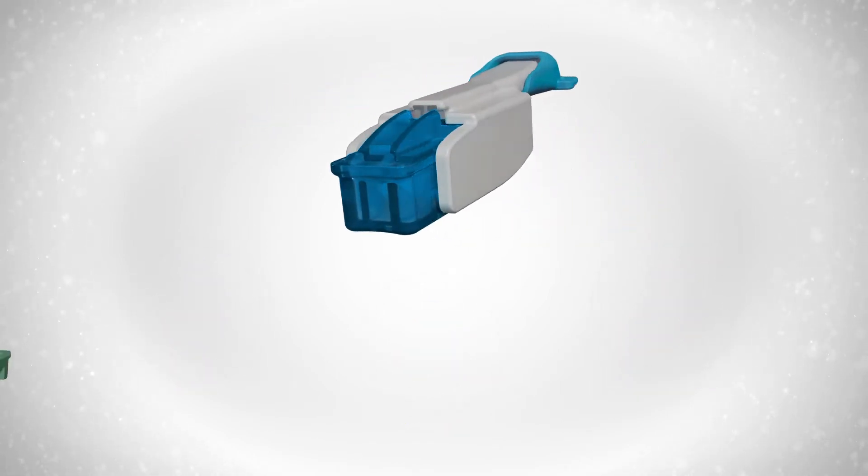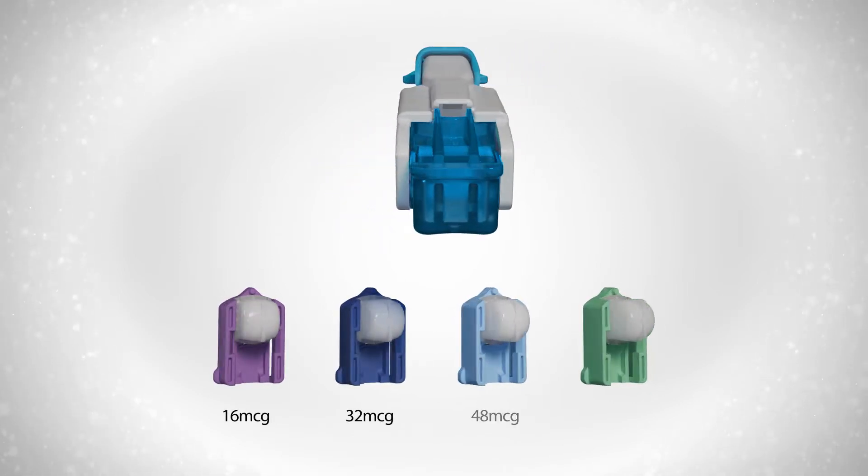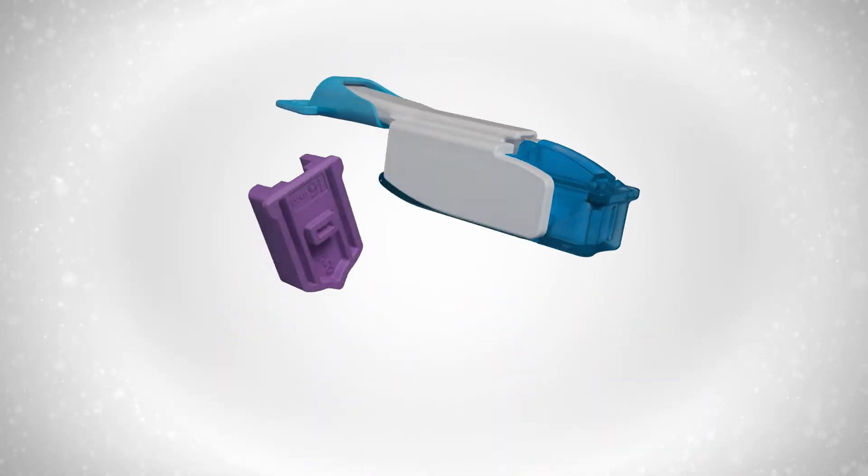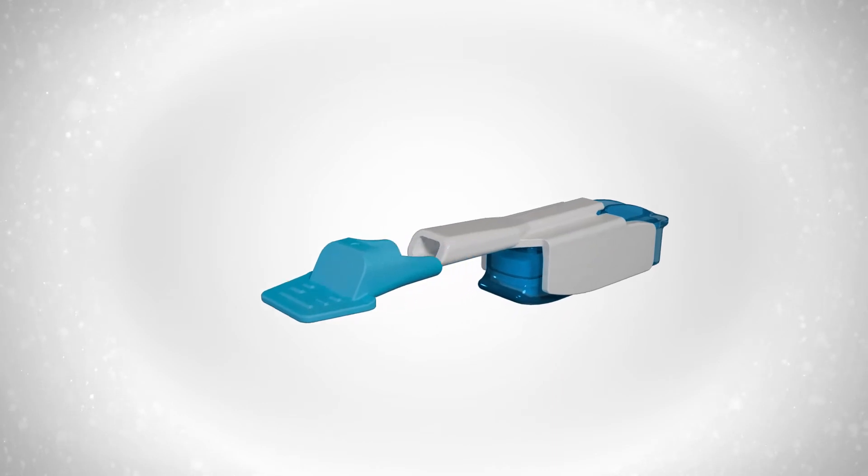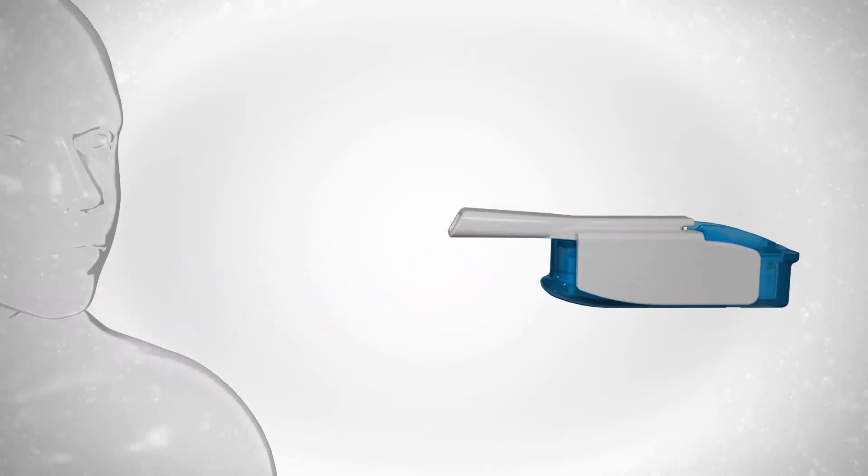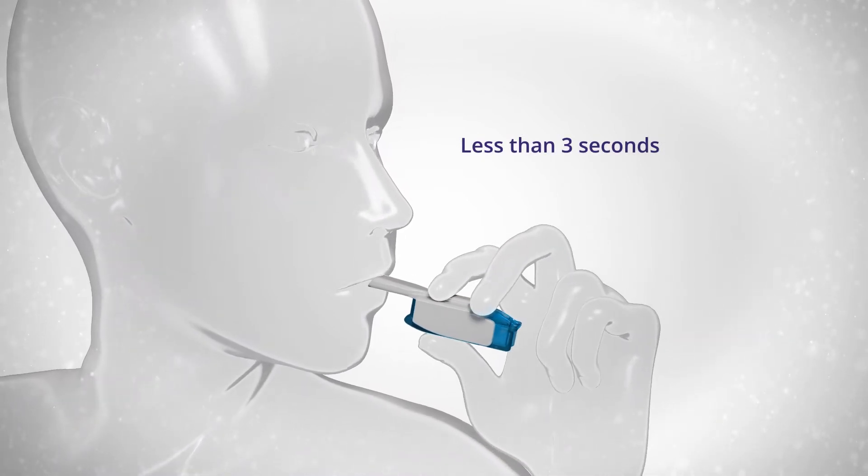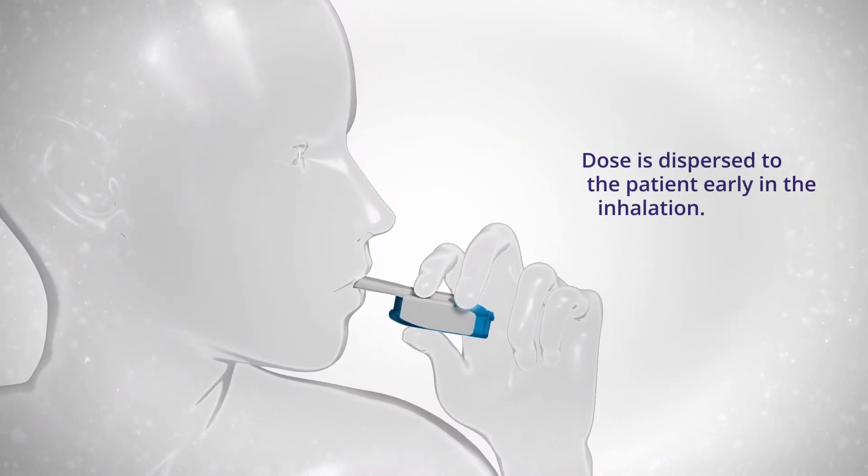Tyveso DPI uses single-use pre-filled powder cartridges available in four dosing strengths for simple flexible titration. There is one cartridge per dose. The patient takes the dose in a single inhalation typically lasting less than three seconds. The dose is dispersed to the patient early in a single inhalation.